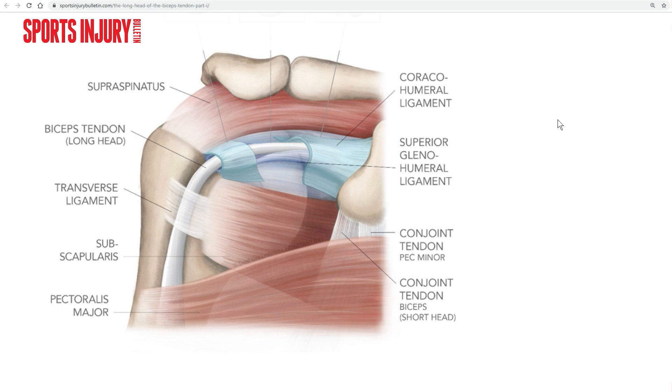Before I start showing you the biceps pulley on MR images we first need to understand what it is and what its function is. You can see here on this illustration that we have the long head of the biceps tendon in the intra-articular segment, then here in the bicipital groove, and then going distally. This tendon nearly makes a 90-degree angle, and in order to keep the tendon in this position during all the complex arm movements you can make, you basically need some kind of structure that keeps it in place — and that is basically what the biceps pulley is for.